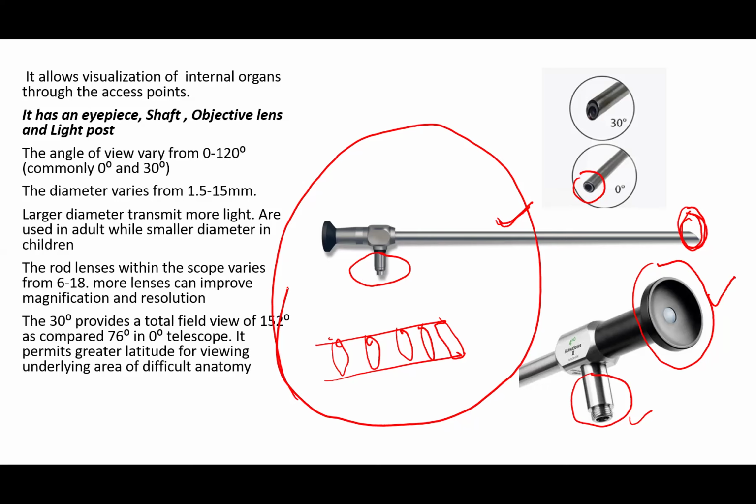Another question: for the final image provided, how do we know the orientation? Is there a particular way to hold the camera to get the right orientation? Yeah, this is a very good question. In the module, there is a lecture on camera handling by the assistant.